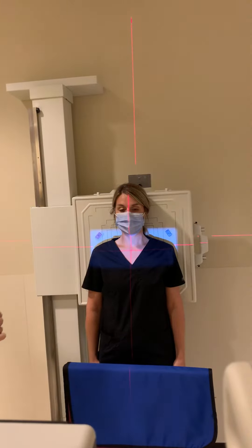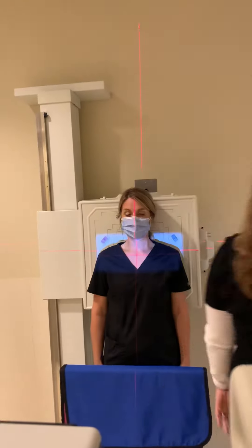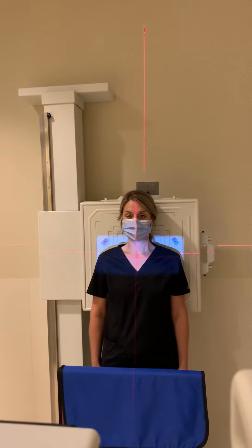We have lead shielding in front of our patient, and we're going to suspend respiration, and we're ready to take the image.